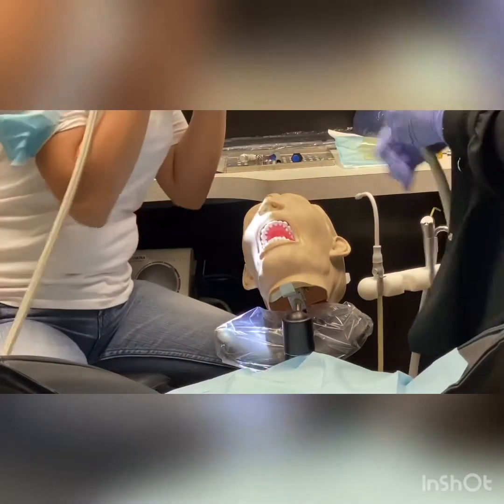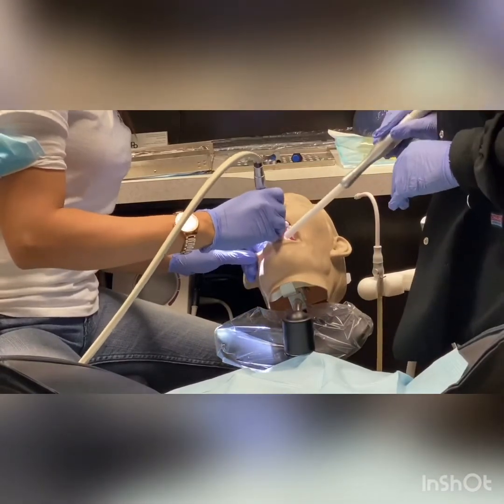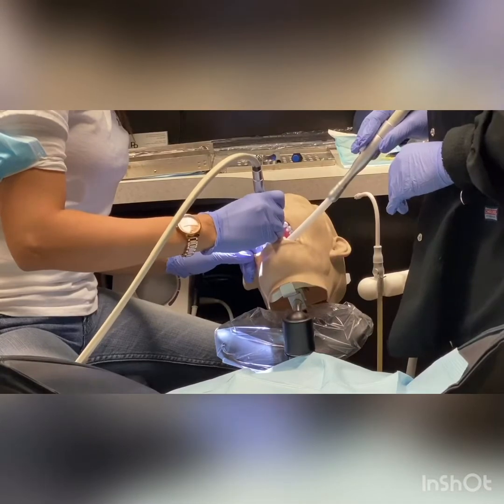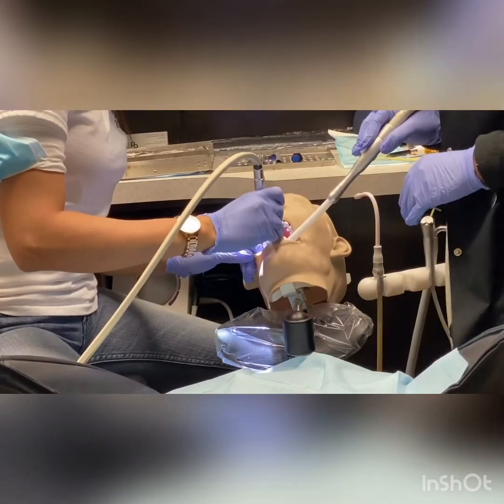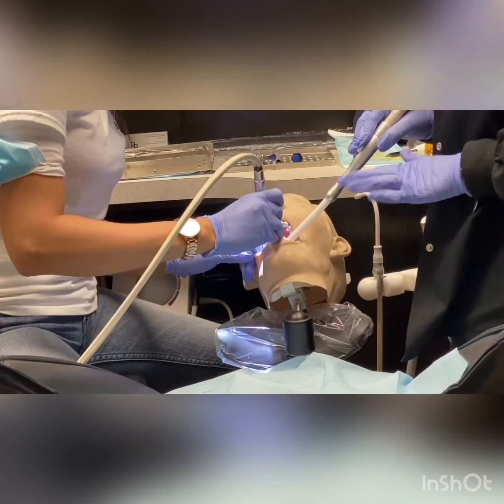Whenever the high-speed handpiece is being used, it's water, so you always want to have your high-volume suction. She's on the lower right, so you're going to place your suction right beside the tube. You don't want to press too hard on their tongue, because a lot of people have a gag reflex.